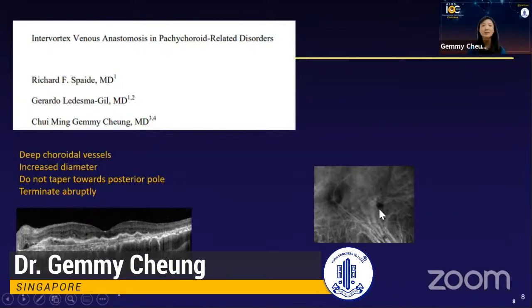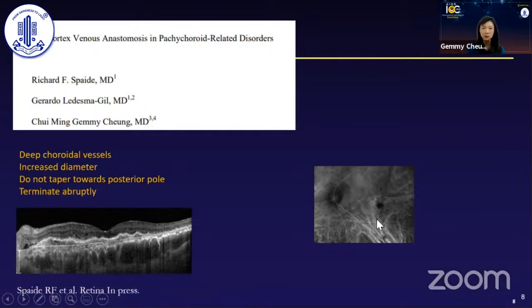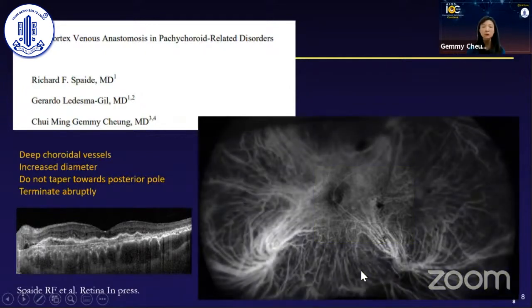So if we just examine the macular region, we can see this kind of image with ICG, or the one that I showed you just now with OCTA. Recently, we had the opportunity to look further out, and this is with wide field ICGA. We find that, of course, we see these vessels either next to the disc or in the macular region, but when we look further out, they seem to be connected to at least two or even more separate vortex systems. As you can see in this example, there are anastomotic connections as highlighted here.